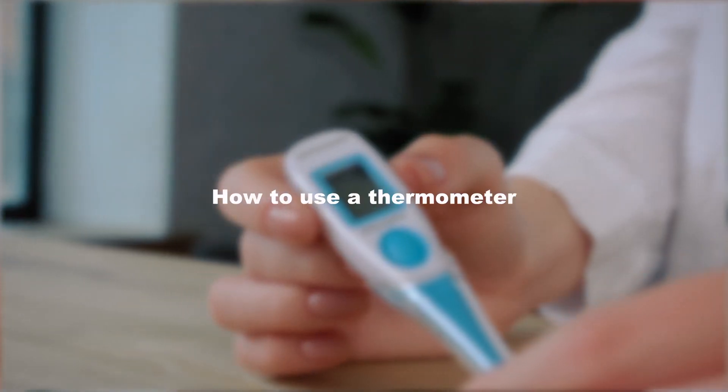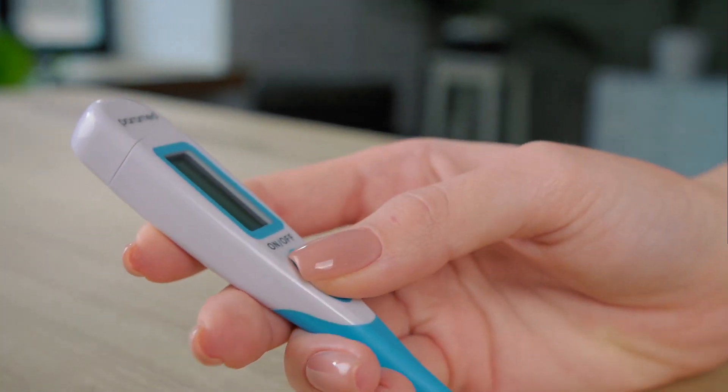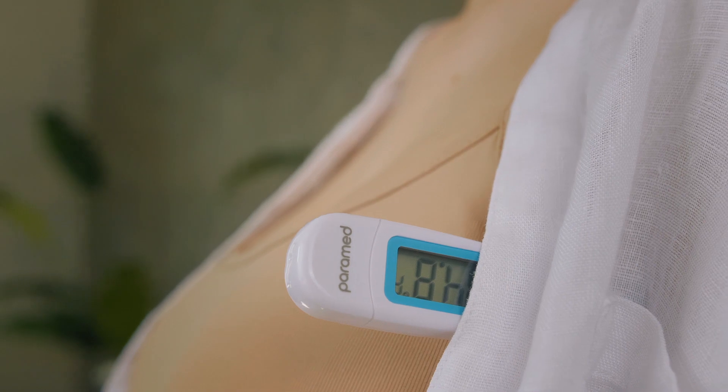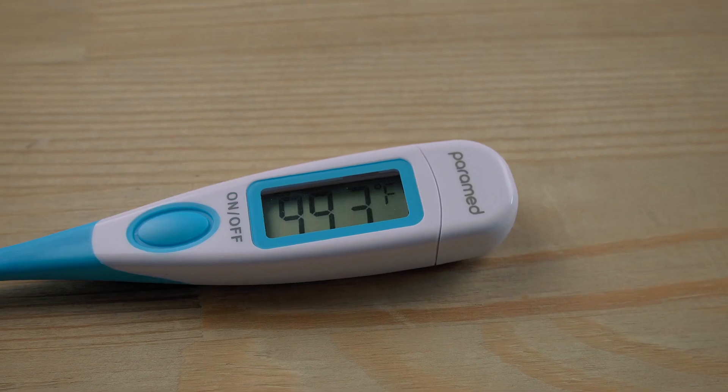How to use a thermometer? To measure the temperature, press the on-off button and place it into the measuring location. The thermometer will notify you with a signal when the results are ready. The signal notifies you that the temperature measuring speed has dropped, therefore we advise you to keep it in the measuring location for a little longer.